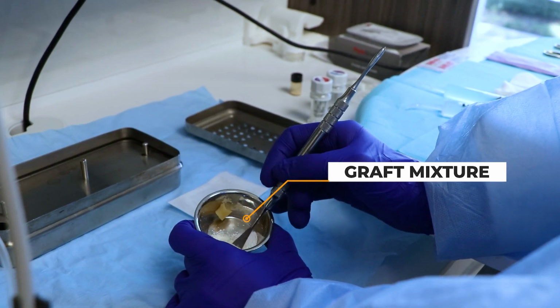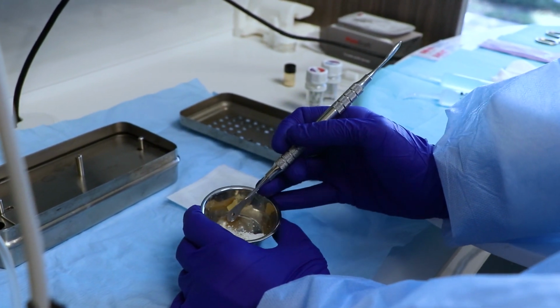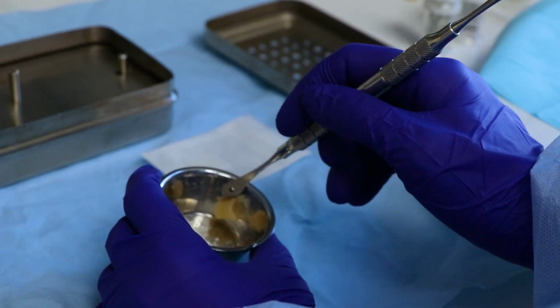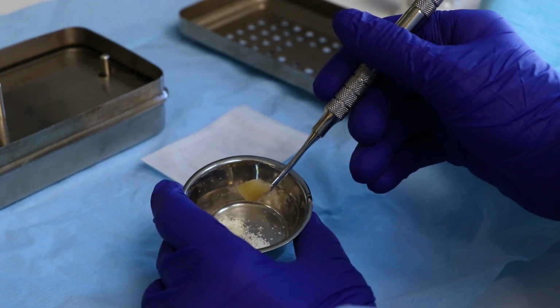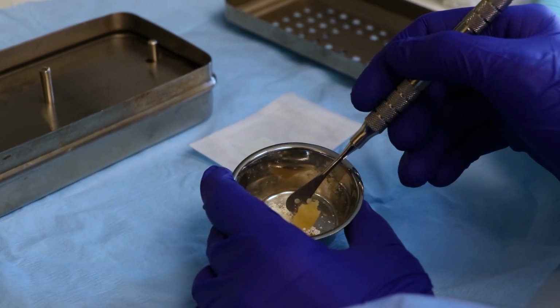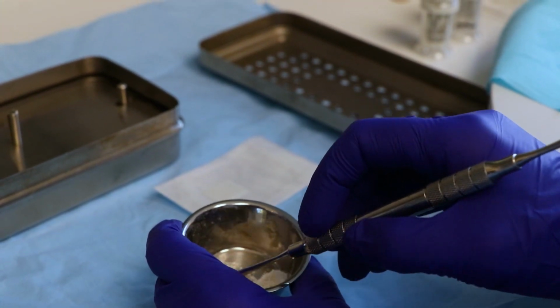But this here is called allograft, and we've learned about that in a few other videos, and basically that is human-derived bone. Here, this whiter material we have is xenograft, and that is actually coming from a cow. And what you see here is putty, and so putty is almost like a glycerin agent that has some allograft material mixed inside of it. But what this is going to do is when I mix these together, now this is going to give me better handling on the material, so I can place the bone graft.